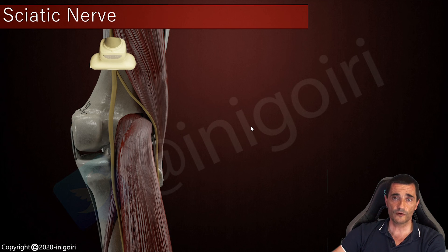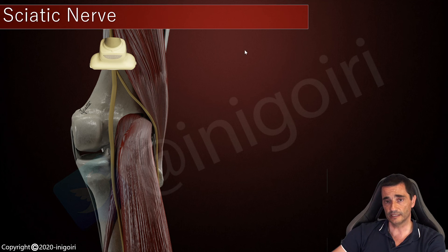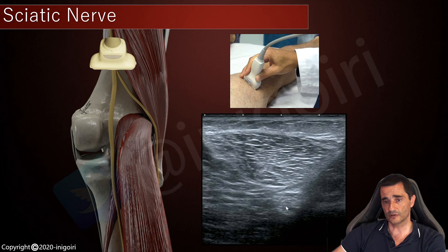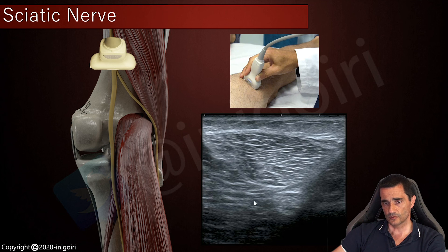Now the distal sciatic nerve. If we follow the nerve distally in the thigh, we will notice its division into its terminal branches — the tibial nerve and the common peroneal nerve. We follow the sciatic nerve, always related with the biceps femoris. This is the two heads of the biceps femoris: the long head with its characteristic trapezoidal shape, and the short head with its quadrangular shape. Between these two heads of the biceps femoris, the sciatic nerve is located deep.